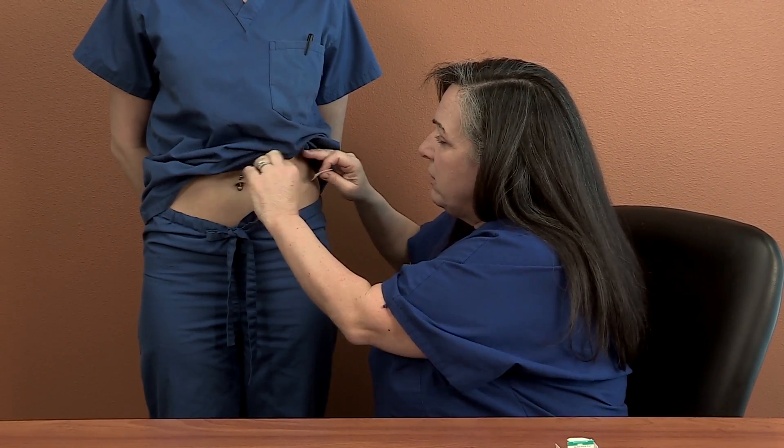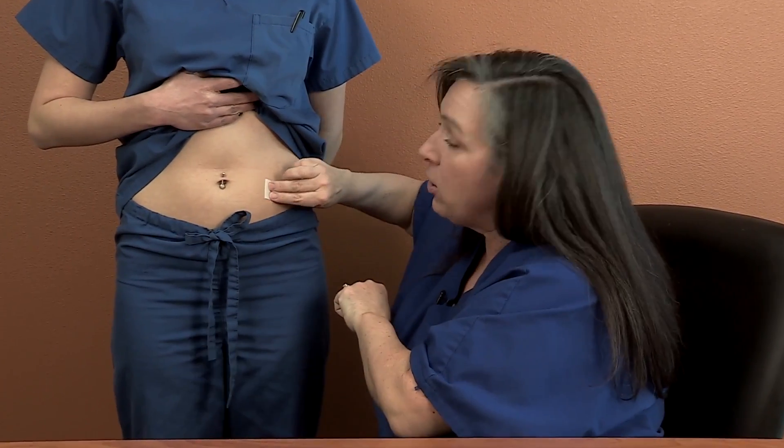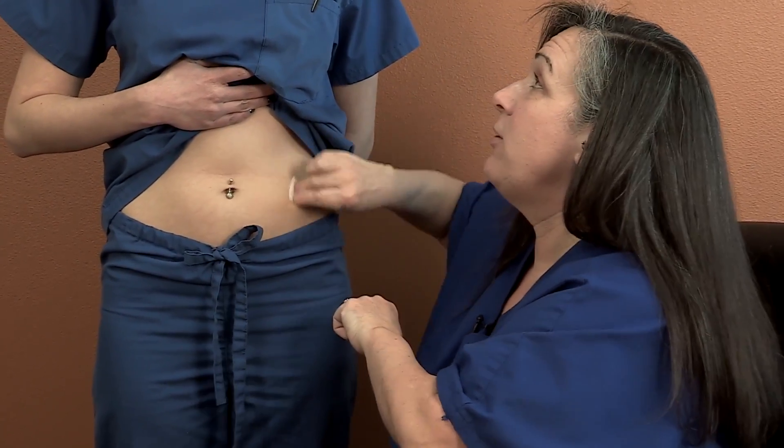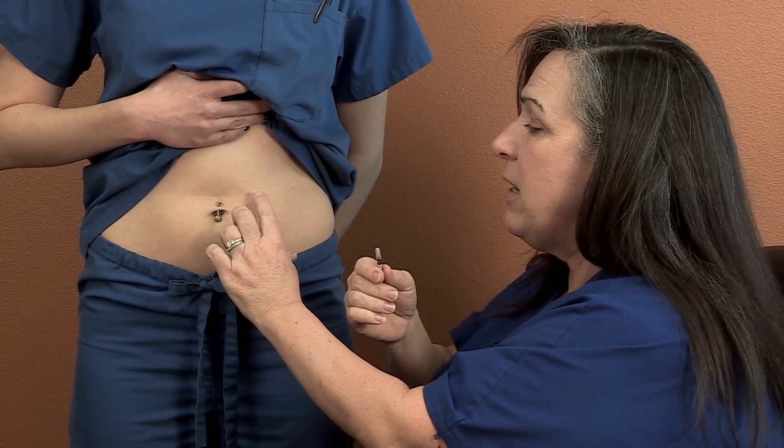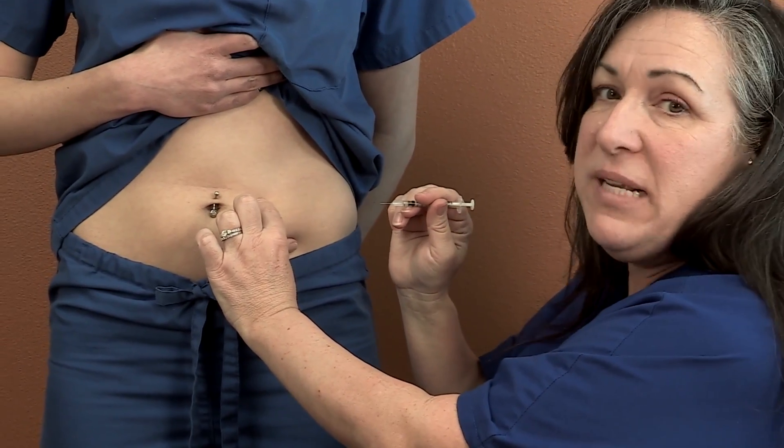So now we've got our Lupron all ready to go. I'm going to find a place to do this — hold that there for me, Chelsea. Pick a spot and always clean it with alcohol. Now, I'm really not going to do this, so don't worry. When I tell you there is no fancy technique here, there's really no way you can screw this up. If that needle went in and you pushed that plunger down, you did just fine. Errors happen because maybe you didn't draw it up right or didn't mix it correctly — pay attention there. You can do this yourself or have somebody do it for you. Just pinch up the fat and I'm all business about these shots.